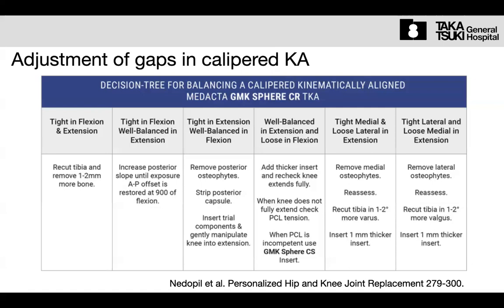One solution is to decrease the femur size. But in this procedure, the posterior aspect of the femur is decreased.